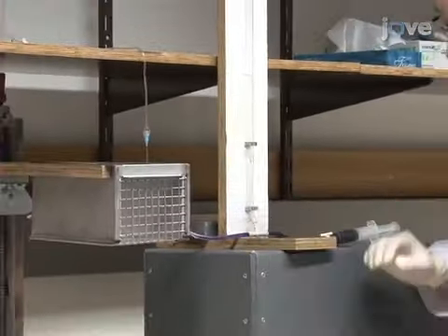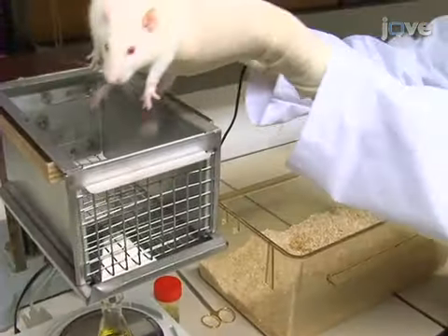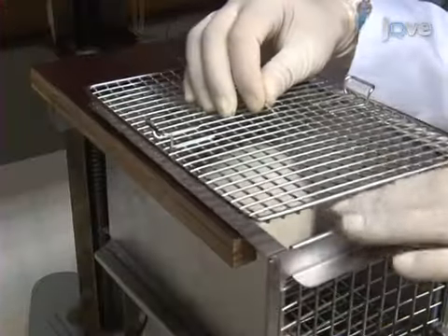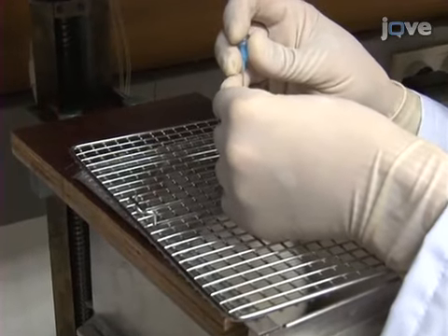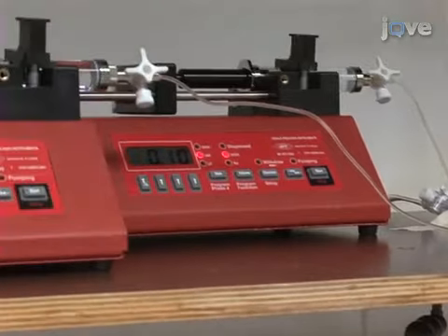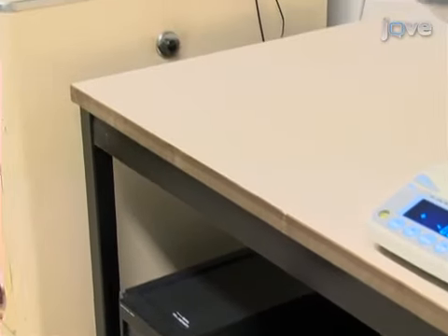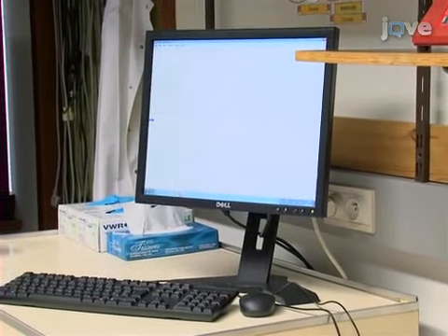Before starting the cystometry, ensure that the instruments have been properly calibrated. Place the rat in a metabolic cage above a receptacle containing oil that rests on a digital balance. The next step is to connect the implanted catheter to a 3-way tap via a Luer stub. The tap should be connected to the pressure transducer and an infusion pump. The pressure transducer is further connected via an amplifier to the data acquisition system and a computer, which utilizes publicly available software.